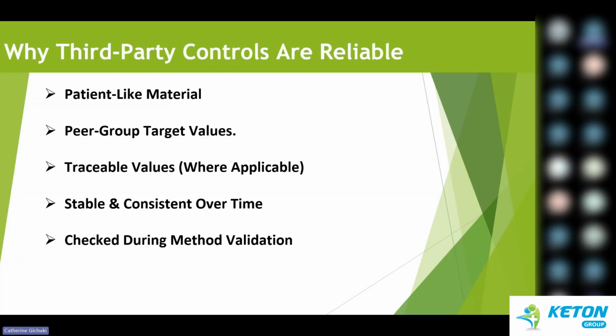That stability and reliability across lots means you can use them over a long period, if you preserve them as we mentioned. They have stringent ways of preservation and handling. If you meet whatever you have been told to do, you can use them over a long time.